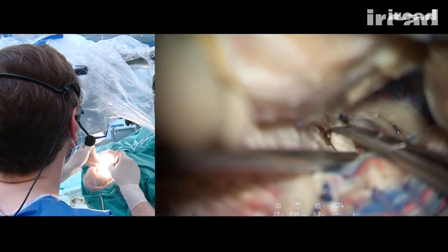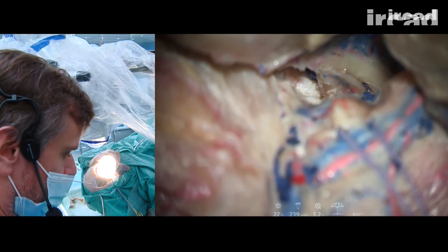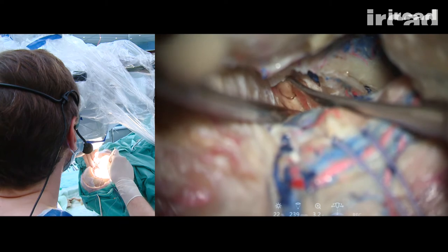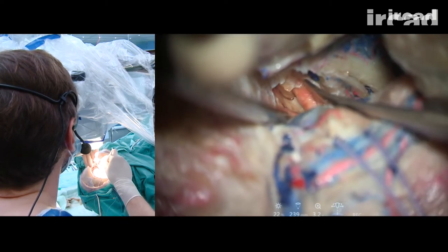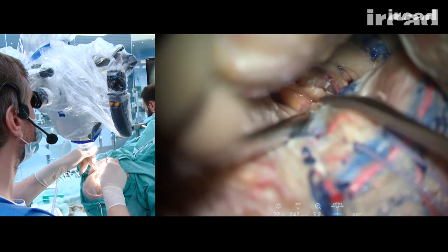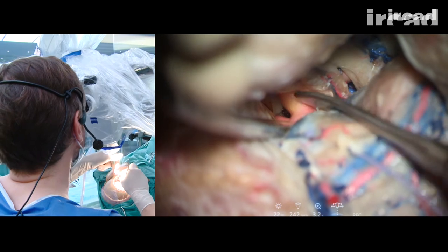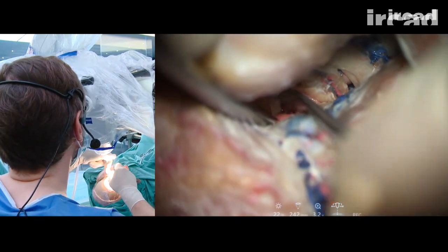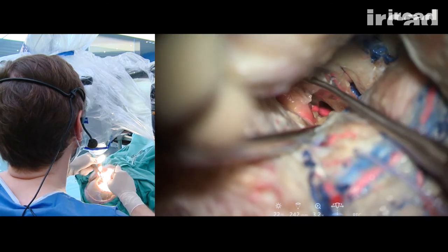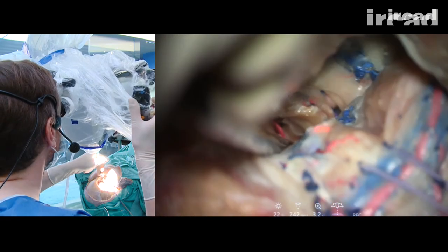Just remove a little bit of dura to be able to see better. So carotid artery, distal dural ring. Carotid artery, A1 segment here. We have third nerve going into the oculomotor cistern.